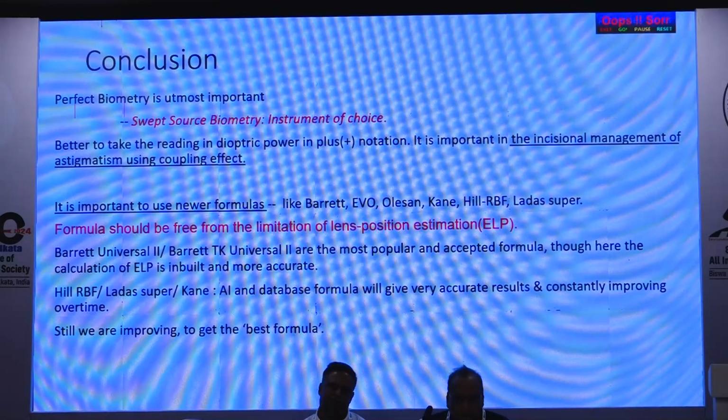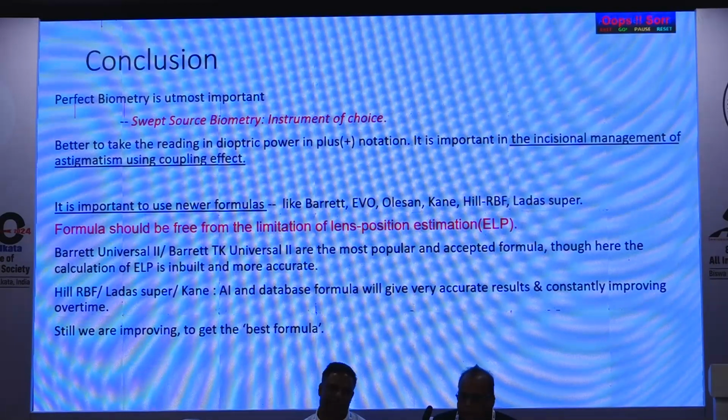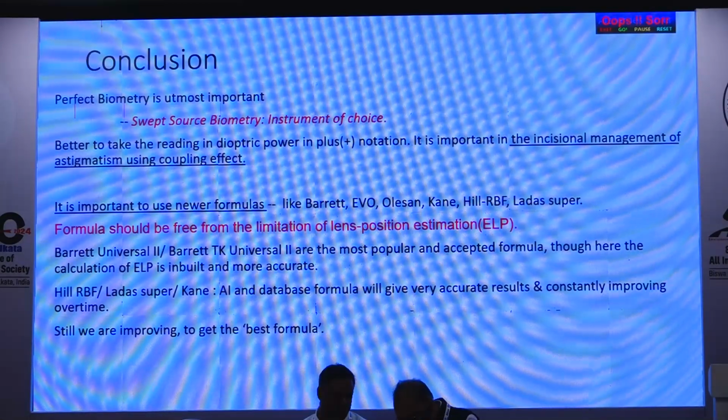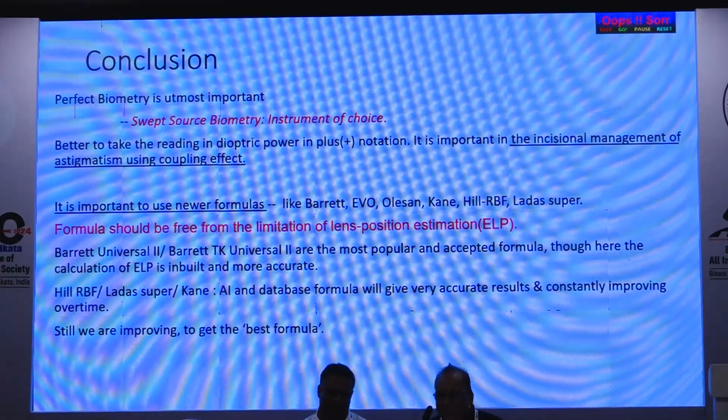The Barrett Universal is the most popular formula, as here the calculation of expected lens position is built in and more accurate. Hill RBF, LADAS, and Kane are very good formulas, and they are improving over time. We are still improving to get better results.